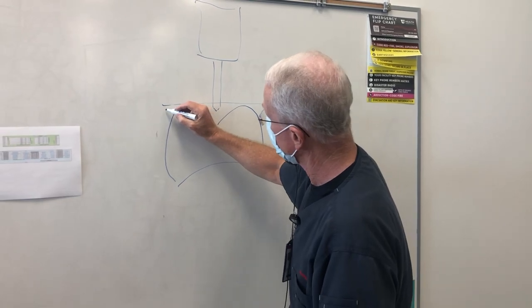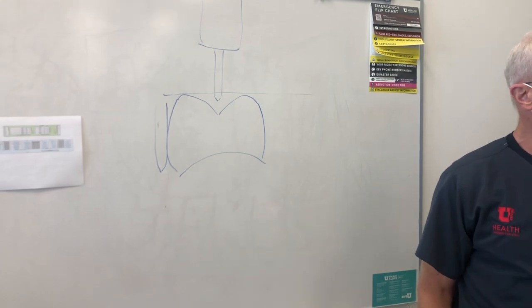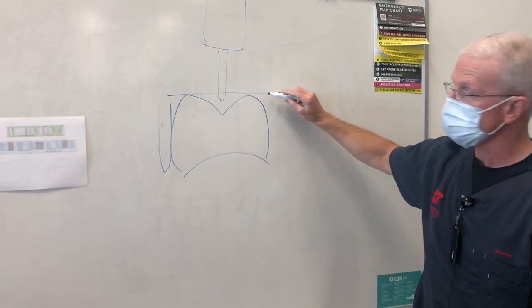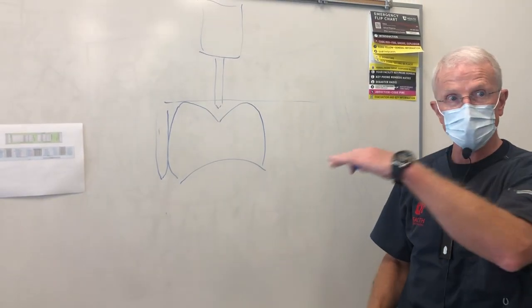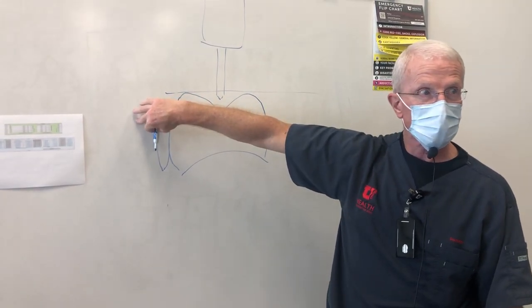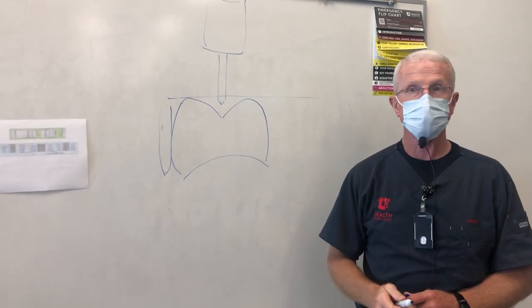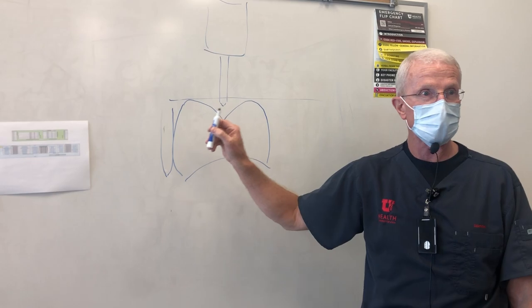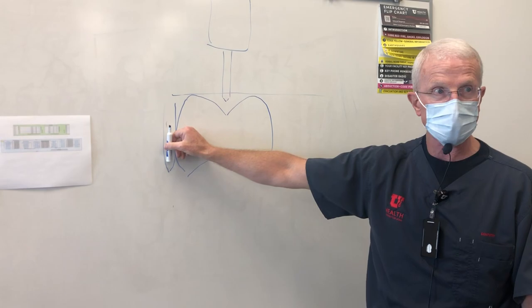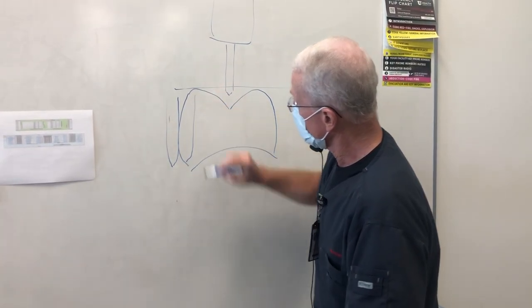Then bring your burr right out here and start your preparation with the side of the burr. And frequently go back to your landmarks on the occlusal aspect of the tooth behind it, and just keep checking this. As you start your preparation, you're creating the axis of that preparation on the buccal axial wall. Forget about the two plane at this point. Just get the axis set up. And you'll end up with something like that.